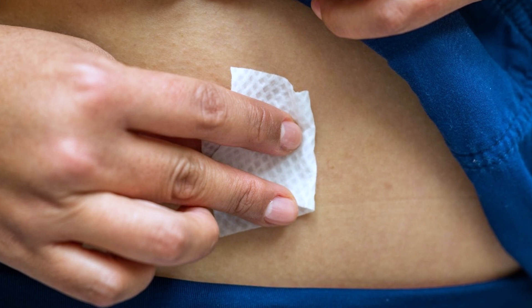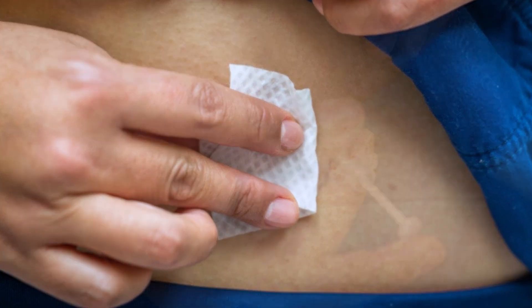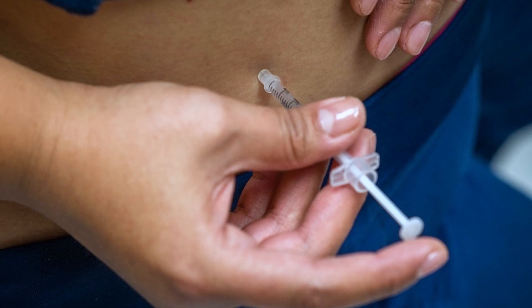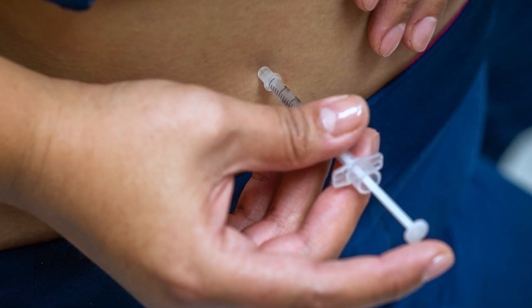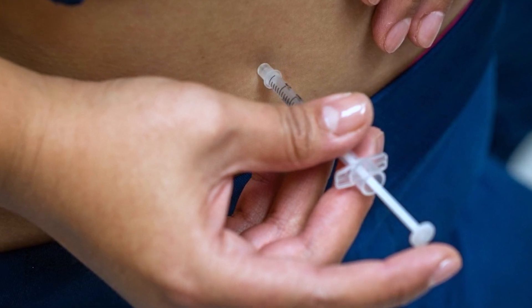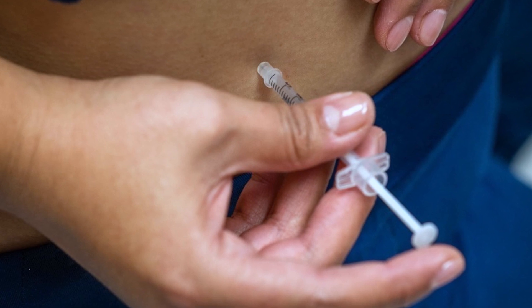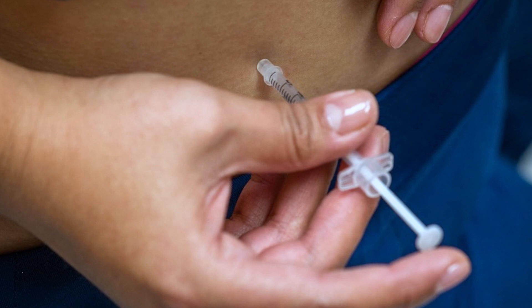Step 6: Clean your skin with an alcohol pad and allow the alcohol to dry completely. Step 7: Pick up the syringe and hold it like a pencil. Do not let the needle touch anything. Quickly push the needle straight into the skin at a 90-degree angle. Push the plunger to inject the insulin and hold it for 10 seconds before pulling the needle out.